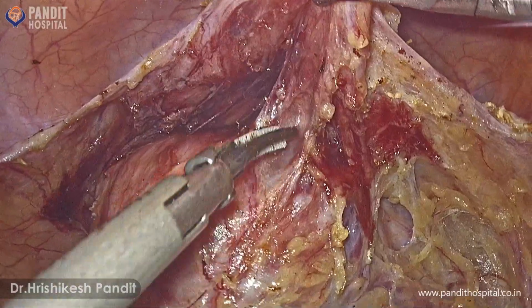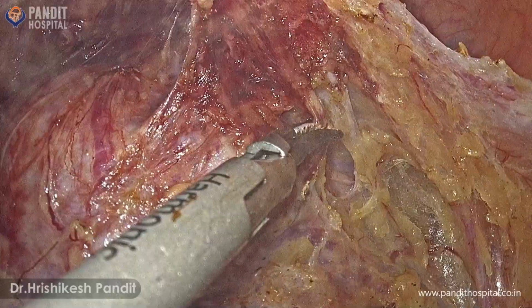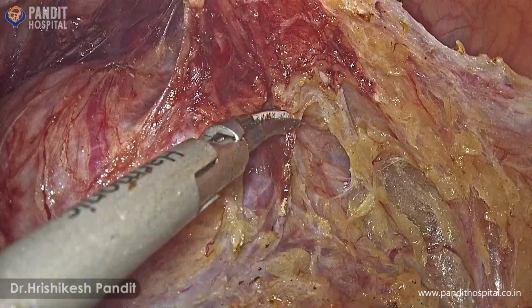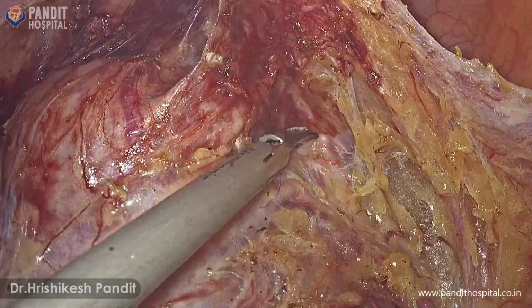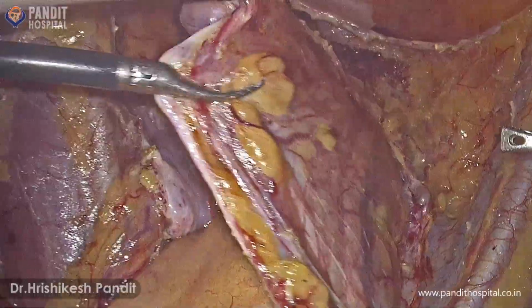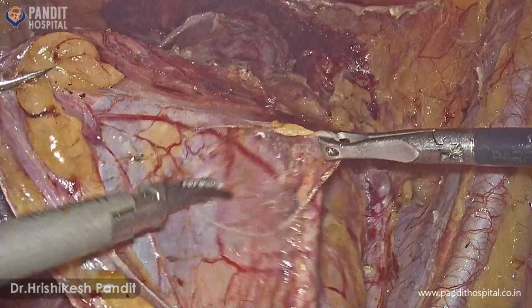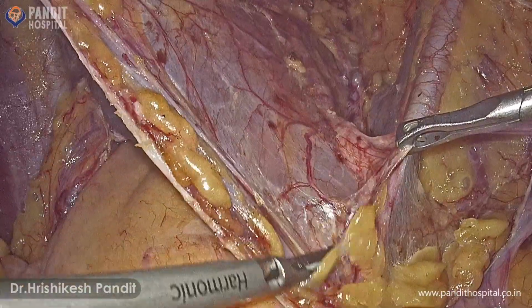Here we are dissecting into the Yabuki space, which is also known as the fourth space. It is a retroperitoneal space between the ureter and the vesico-uterine ligament. It contains pelvic splanchnic nerves supplying the bladder. It is important to conserve these fibers during nerve-sparing type of radical hysterectomy.